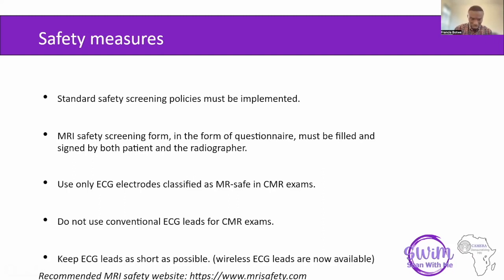At least for the first trimester, because of these radiofrequency pulses and some of these examinations, even though it's cardiac imaging, there are a lot of improvements where we are not going to use contrast agents and other things. But if there is a need to use contrast agents, what are the precautionary measures and what is the effect?